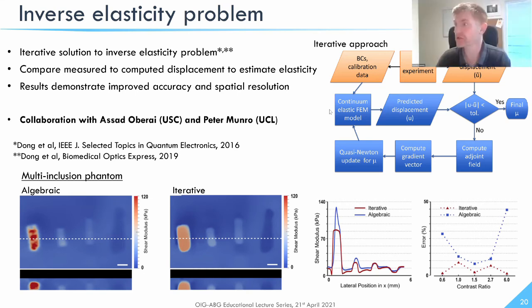Yeah. So the first question, Steve, the answer is that we're currently building the high-res system ourselves in the lab because it's difficult to get that commercially, but we've reverted to mainly using commercial systems. Most of our systems are from Thor Labs, so the only technical adaptation you need to make is to synchronize your actuator deformation with the acquisition of the B-scans, but that's straightforward. You can basically just take a line from the camera acquisition and synchronize, even with a standard signal generator, you can synchronize the actuator in that way.